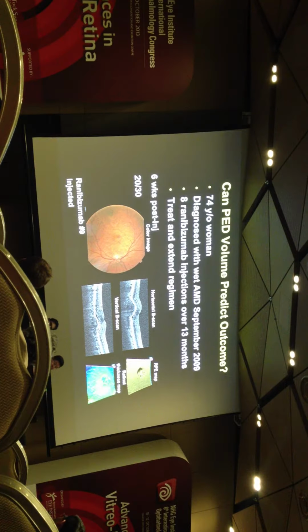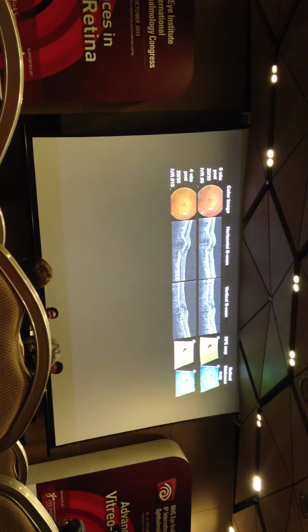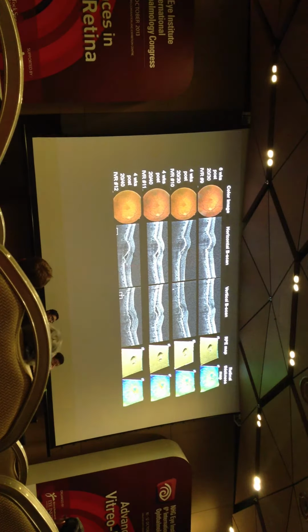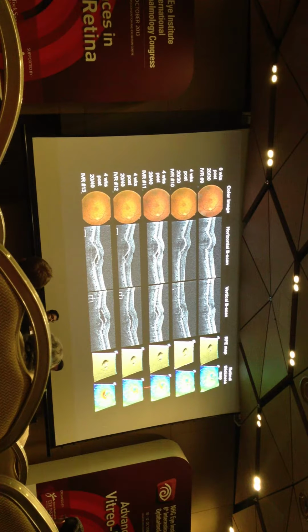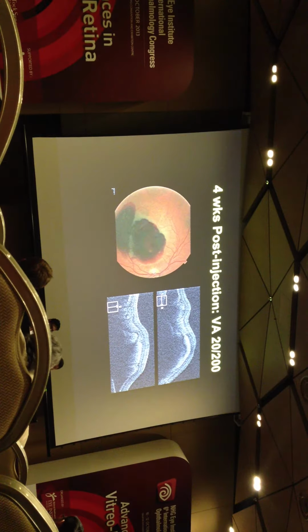Okay. So here we have a patient, a 74-year-old woman who'd been undergoing multiple ranibizumab injections. This is what she looked like 6 weeks post-injection, a little fluid here. So we were using a treat and extend strategy. We decided, no, it's time to cut back from 6 weeks back to 4 weeks. So here that patient is at 6 weeks, we treat, comes back at 4 weeks, and there's more fluid. 4 weeks later after injection, more fluid, and lo and behold, you see the fluid accumulating, and the next visit, the patient really deteriorates. You want to avoid this.